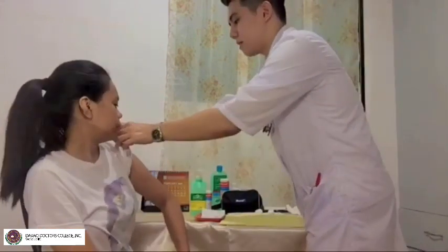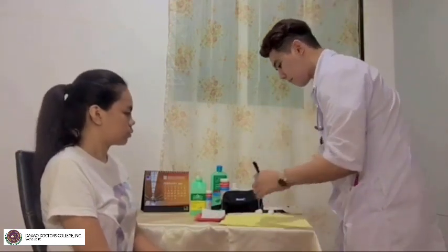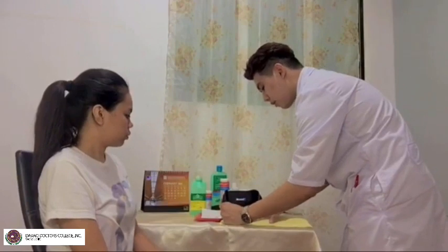Okay. So karon ma'am kay ano na lang ako ha? Sige, salamat. Okay. So record the temperature reading in the worksheet and recheck the temperature if it is obviously too high, too low, or inconsistent with the client's condition. So we need to wash the thermometer if necessary and return it to the storage location and document the temperature to the client's record. Example, the VS monitoring sheets. So, butang lang ako ma'am ha.